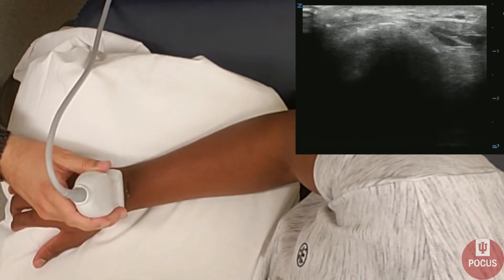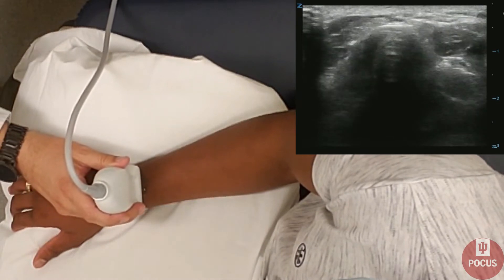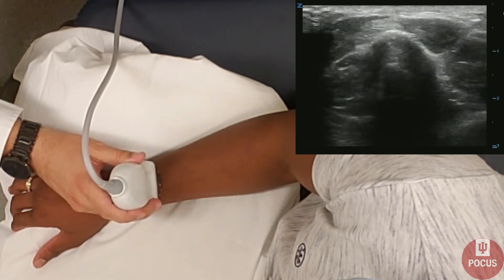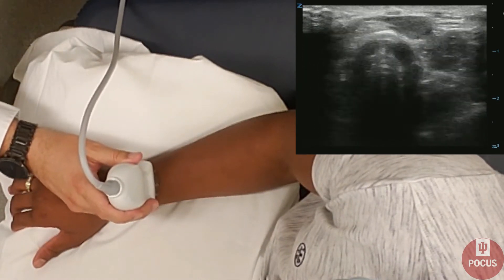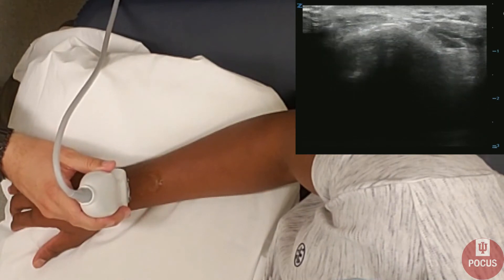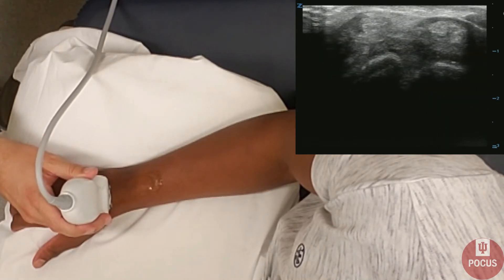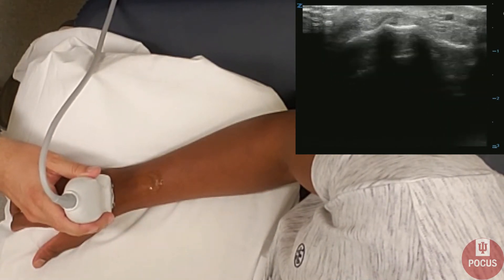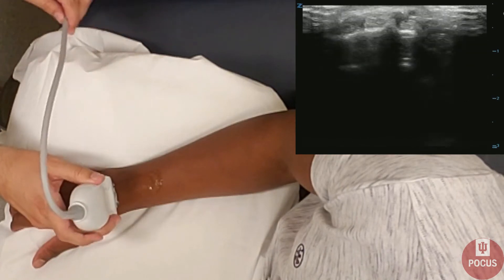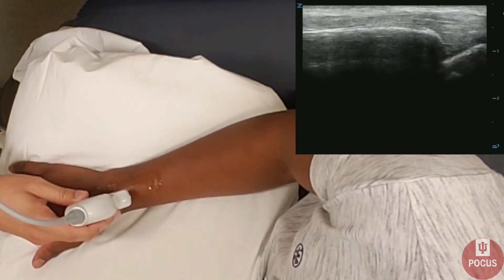We're going to evaluate the radius for any signs of cortical disruption, which could be a fracture. We're going to look both distally and proximally, looking for any signs of cortex disruption which could signify a fracture.